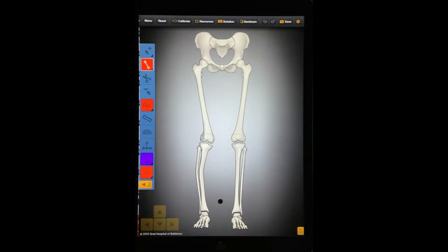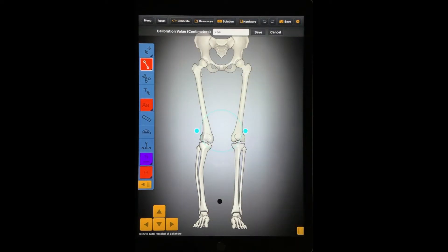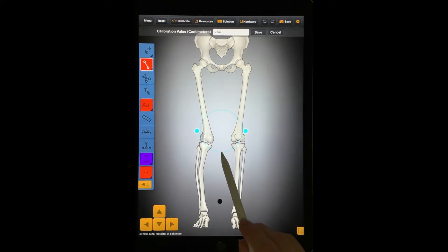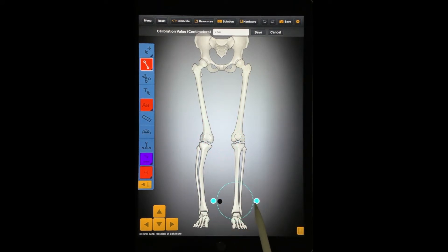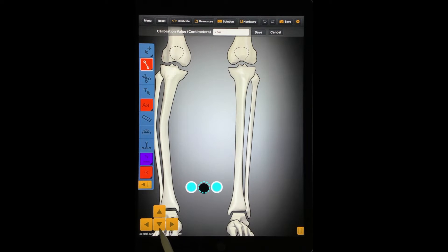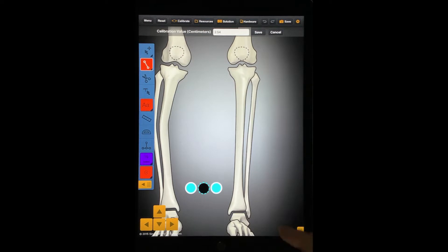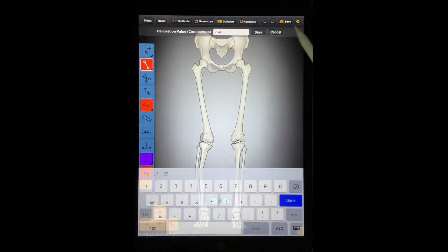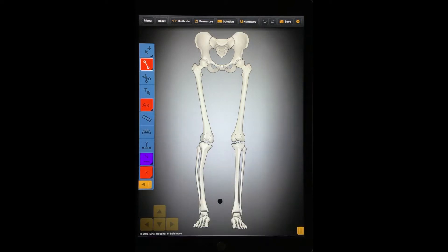First, you should calibrate your radiograph before working on a case. After you press the Calibrate button, a Circle tool will appear. By using the two solid blue circles on either side of the dashed circle, you can align the Circle tool so that it overlaps the magnification marker on your X-ray. You can use the Nudge tool to move the circle accurately. Then enter the diameter of the magnification marker in the Calibrate field at the top of the screen. Our pre-loaded cases contain 1 inch or 2.54 cm diameter magnification markers. Be sure to press the Save button to record your calibration value.